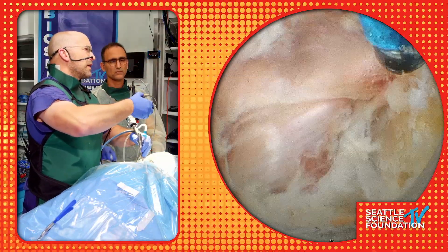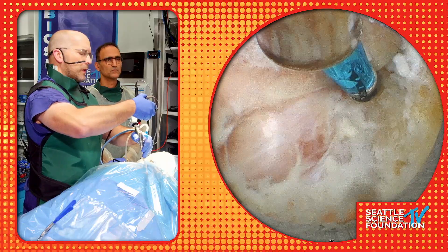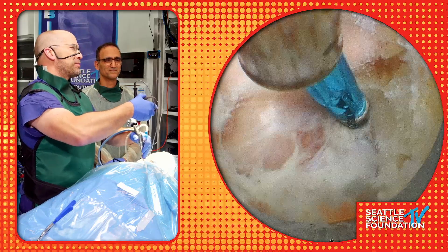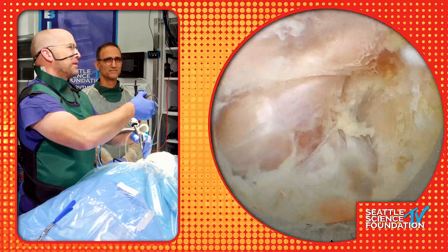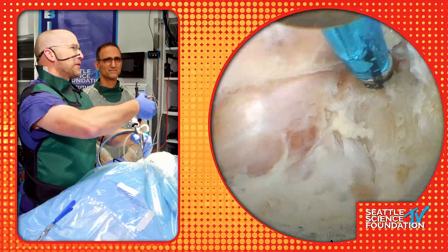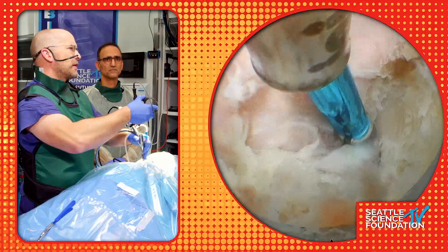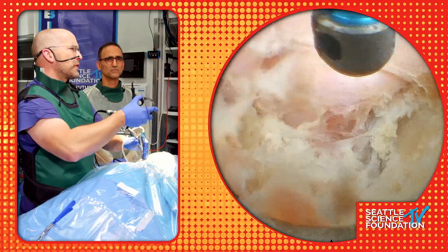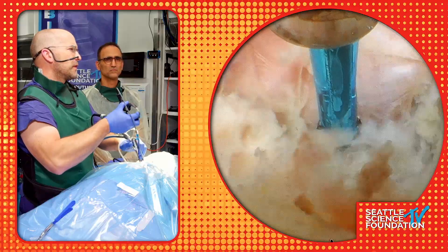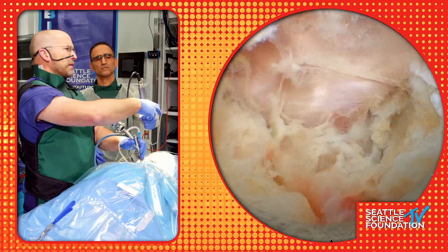Here is the C5 pedicle — it's medial here. We're having a discussion because it looks like I have huge biceps — probably from the endoscopes being so heavy! Anyway, here is the C5 pedicle. Follow this out and right on top of the pedicle you always find the nerve root. Here is the C5 nerve root, still a little covered. Now I know exactly what to do — the last little drilling and Kerrison bite and we're done.